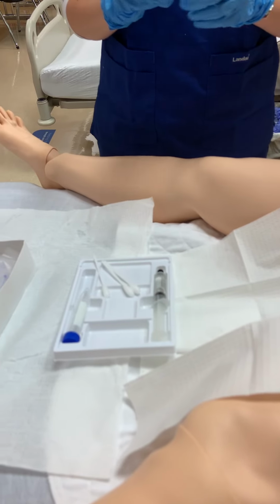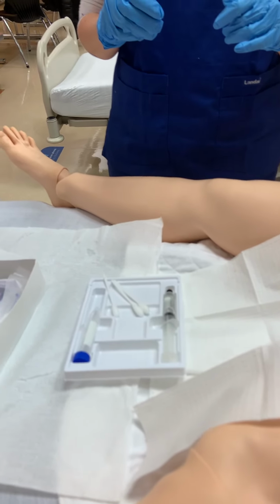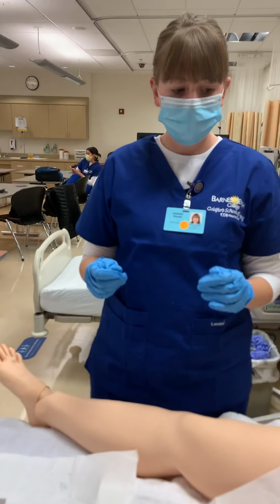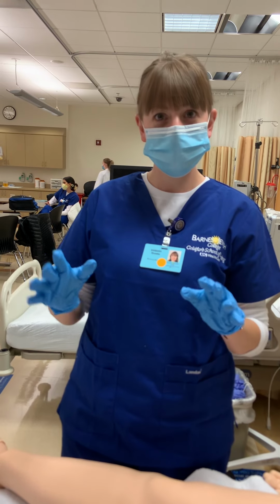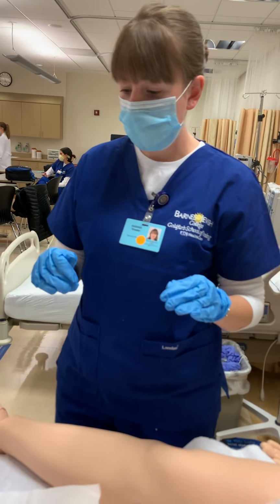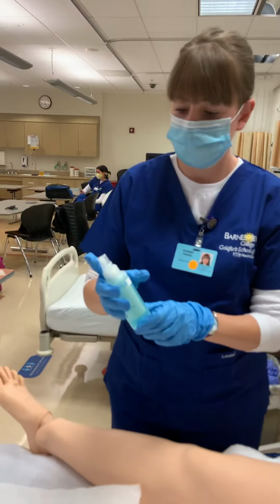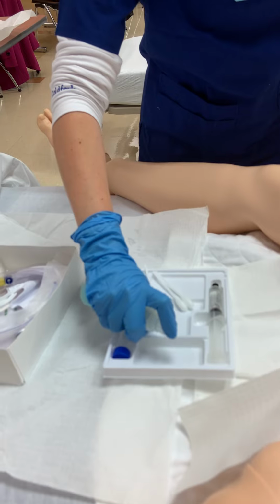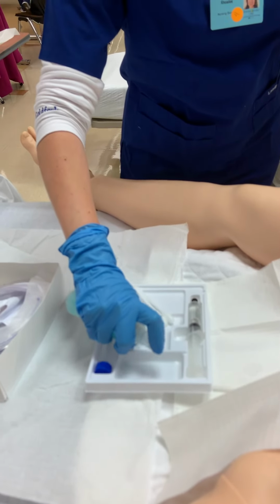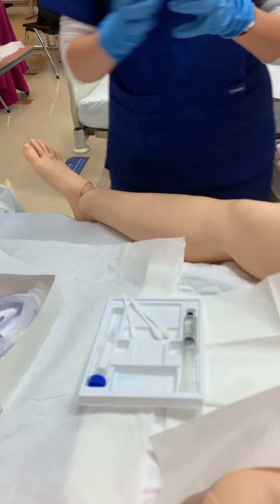Now, usually I would be using the lubricant that comes in the Foley catheter kit. However, for the models we are using a spray. So this does not seem sterile. However, like I said, I would normally not be breaking the sterile field to use this. So typically I would just use the lubricant that comes in here, but instead I'm using this. Okay.